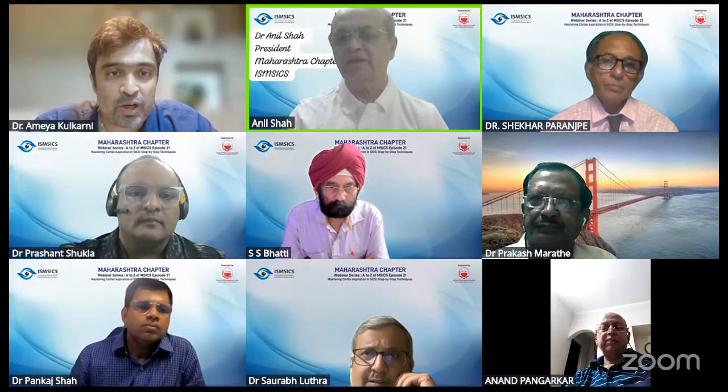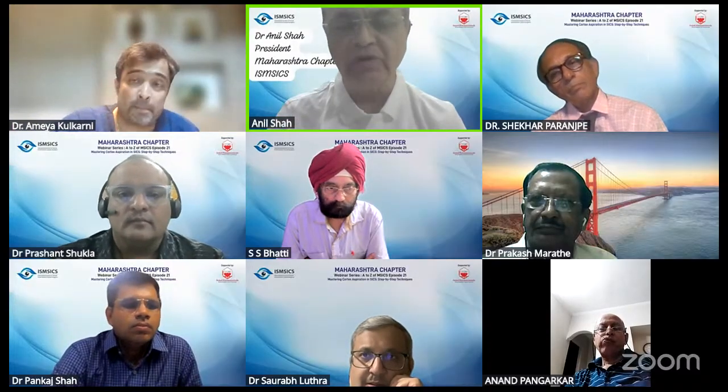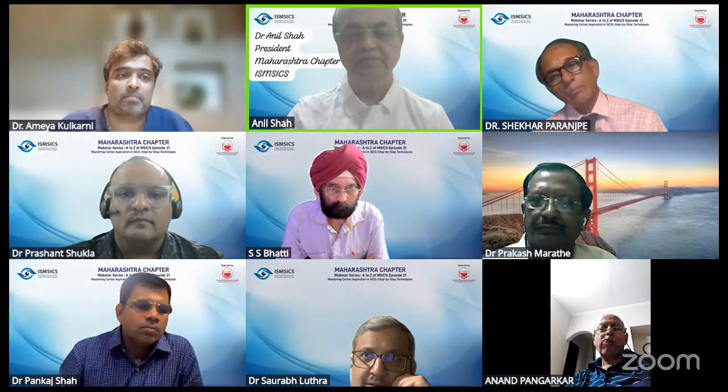What a wonderful innovation there. I'm sure we'll have a lot of discussion over it. But before we go to the discussions, we will have a small video by Dr. Anil Shah, sir. He would like to present a small video. I will share my technique of bimanual irrigation aspiration.